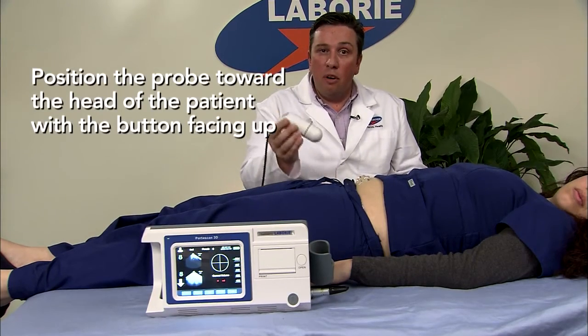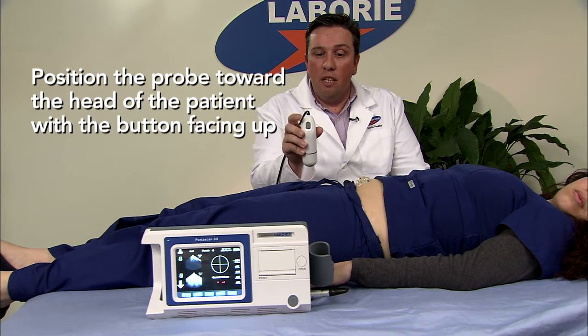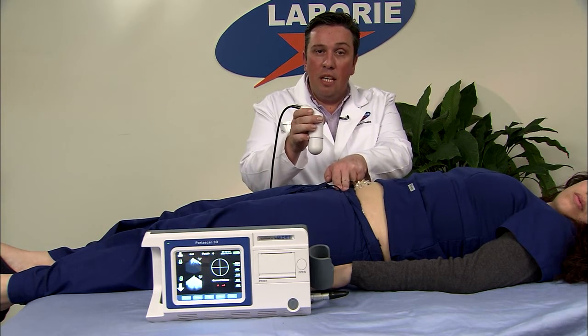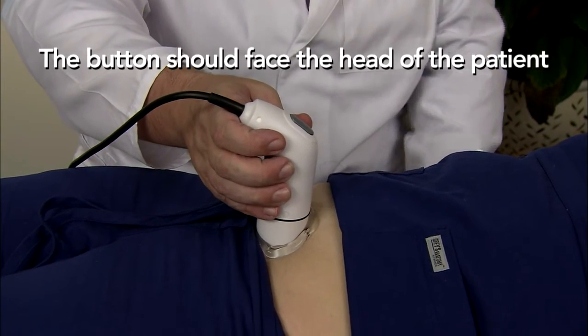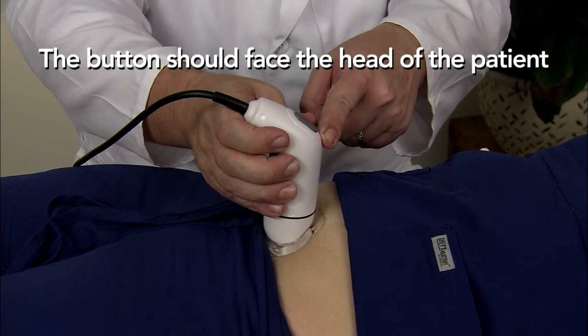When positioning the probe, always make sure that it is positioned towards the head of the patient, with the button facing upwards. At this point, you want to locate the pelvic bone first, then go two finger widths above the pelvic bone before placing the probe. The button facing towards the head of the patient is the correct orientation for the probe.